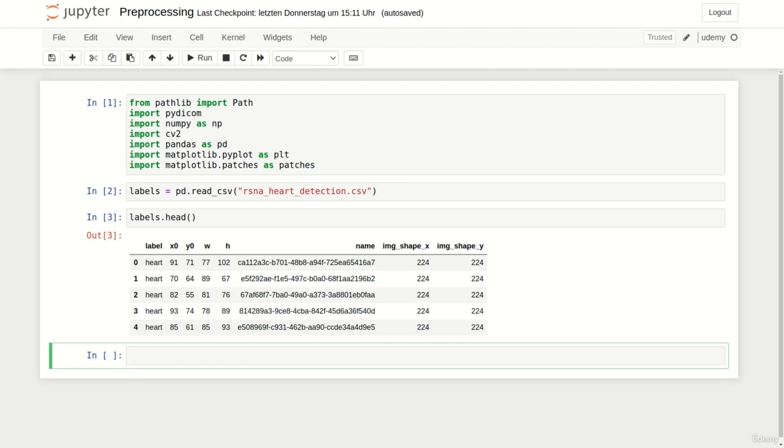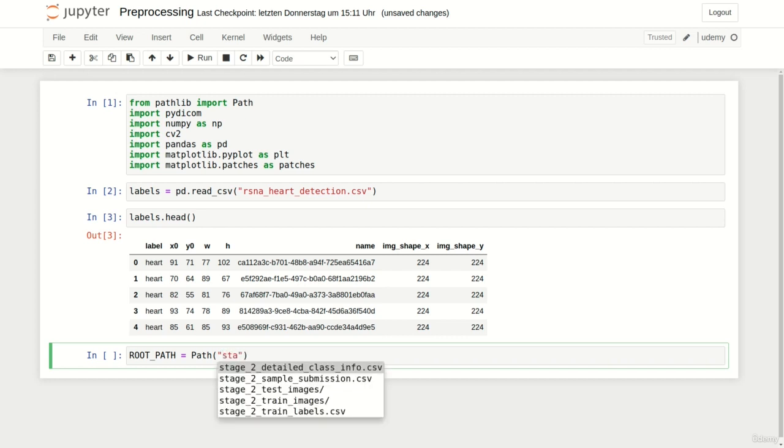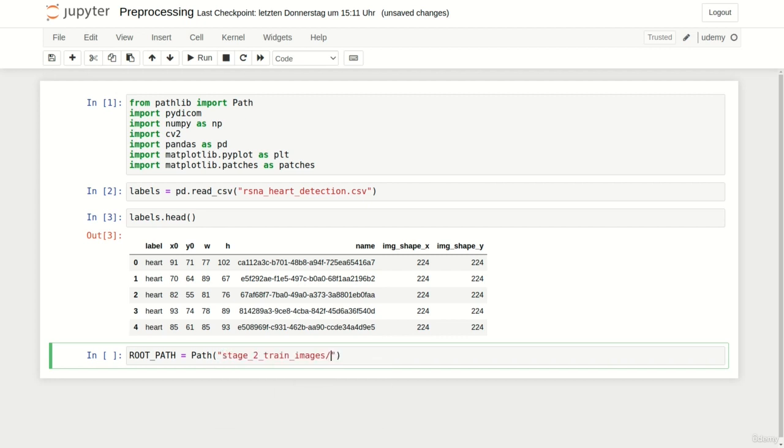Now it's time to define the root and the save path and visualize some images with corresponding bounding boxes after that. As we want to reuse the original images provided by the RSNA pneumonia detection challenge we can use the same path as we did in the last preprocessing lecture. Please make sure to adjust this path to your corresponding directory.